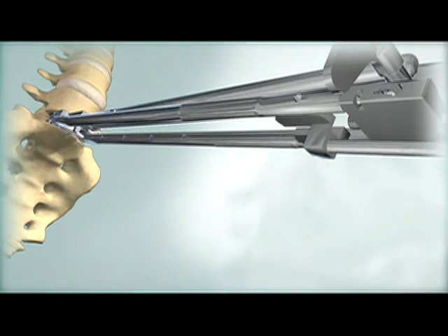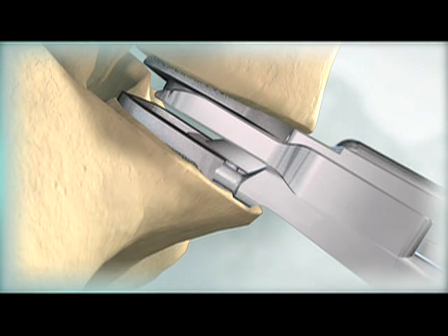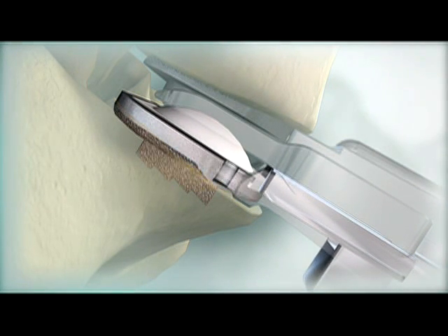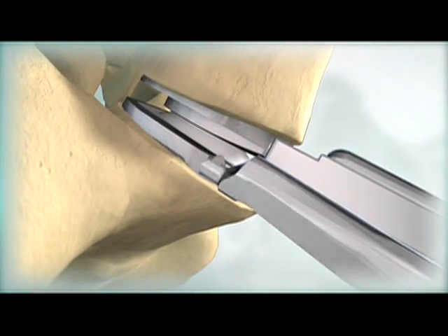Insert the inlay pusher into the grooves in the inferior arms. Manually push and lock the polyethylene inlay into the inferior end plate. Remove the instruments and verify final implant positioning.